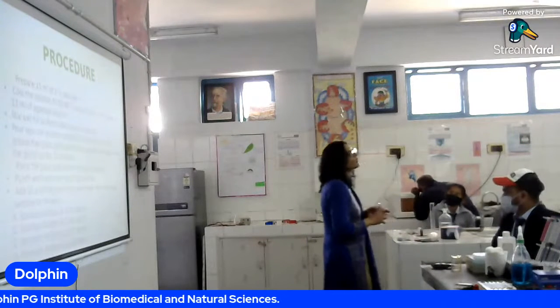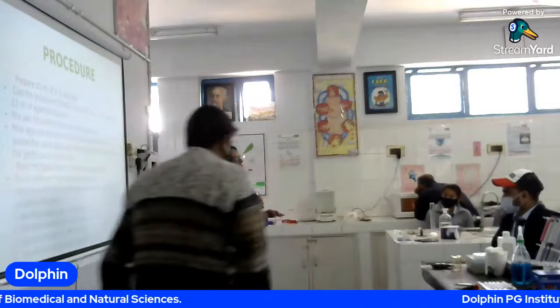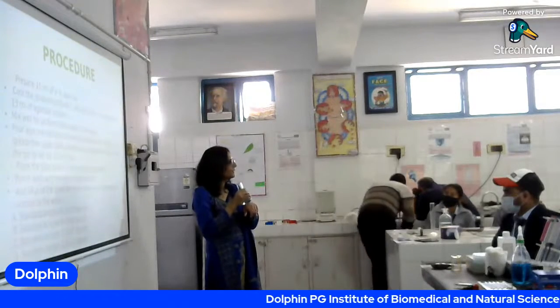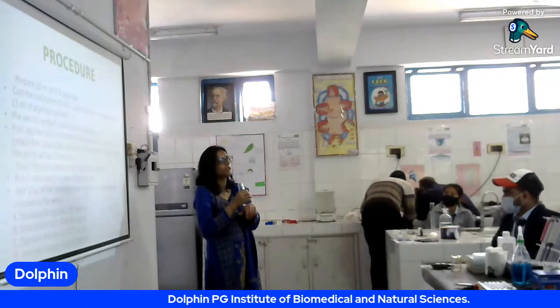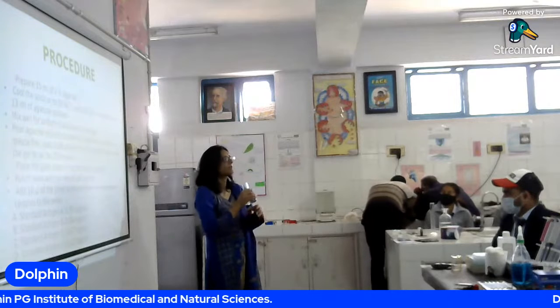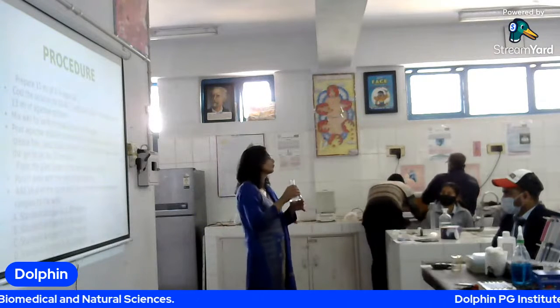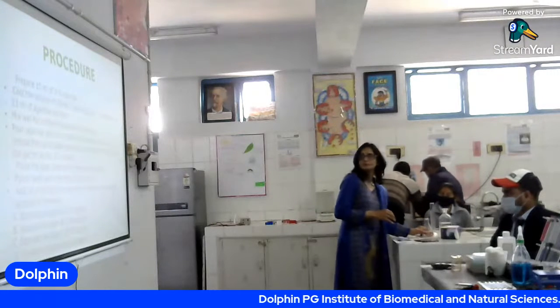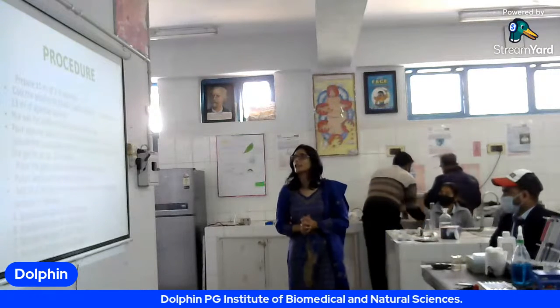It will get denatured. So when हमने solution बना लिया है, then we will check it on back of the hand. अगर हमें tolerable लग रहा है ये ठीक से है, अब tolerate हो रहा है हमें अच्छे से, तभी हम इसमें अपना एंटीसीरम डालेंगे. नहीं तो क्या होगा? और एंटीबॉडी जो है वो denature हो जाएगा. The protein it can get denatured.